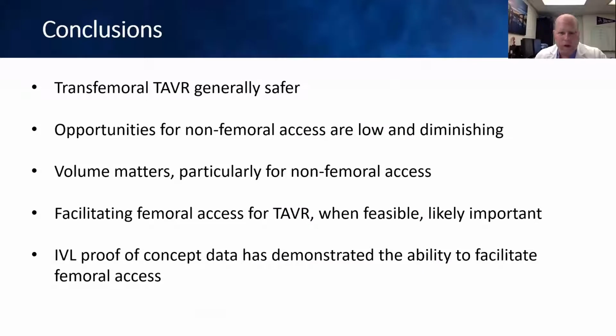Just by way of conclusion, let me reiterate, transfemoral TAVR is generally safer. I think we can all agree to that. Opportunities for non-femoral access are low, and they seem to be diminishing as the technology gets better and the sheath sizes decrease. Volume appears to matter, particularly in non-femoral access. So if you're not going to do more than a handful of alternative access cases per year, I think you should think very carefully about whether or not a facilitated femoral access strategy might be right for your hospital center.